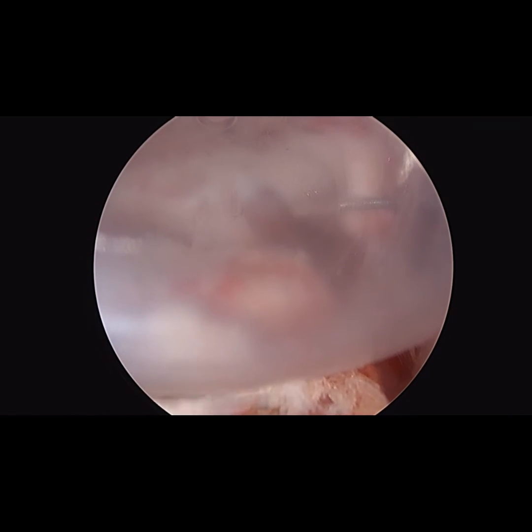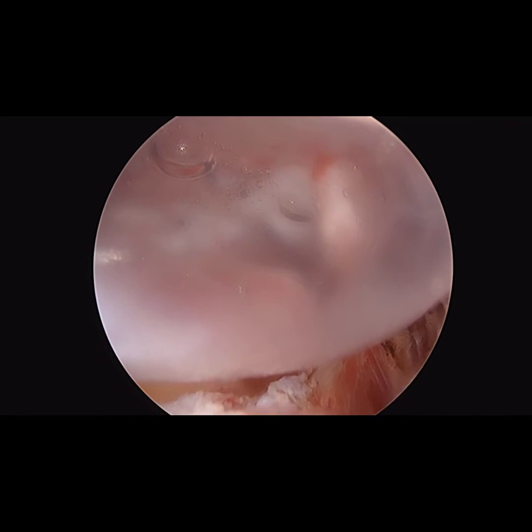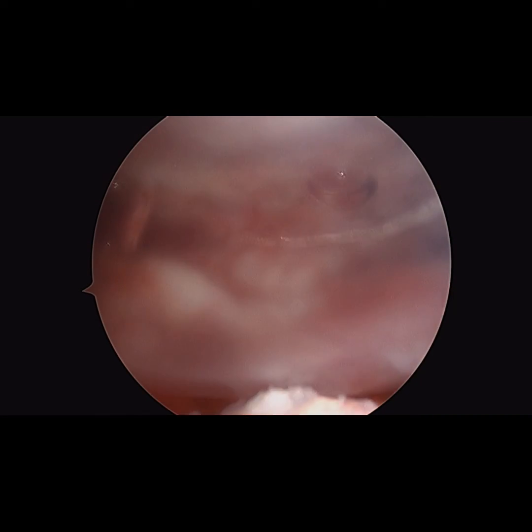Once the balloon is filled, a small amount of saline is then withdrawn and the inserter is then removed. The shoulder was then taken through a gentle range of motion. The balloon was found to be completely stable in the subacromial space, and the patient can then begin rehabilitation immediately.